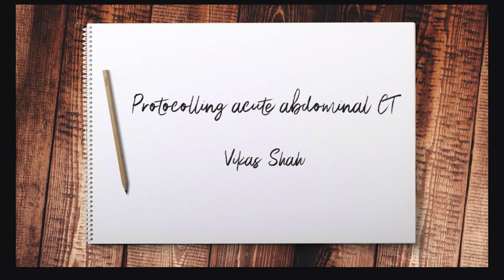Okay, so that's everything I want to talk to you about protocoling abdominal CT. So once again, remember, it's all about whether or not you're going to give contrast and then the timing of the contrast. There's a couple of scenarios where non-contrast CT is useful. Renal colic assessment is the main one, but also as part of a multi-phase protocol for bowel ischemia. Most acute abdominal diseases require just a single portovenous phase, such as your various itises, diverticulitis, appendicitis, and so forth.